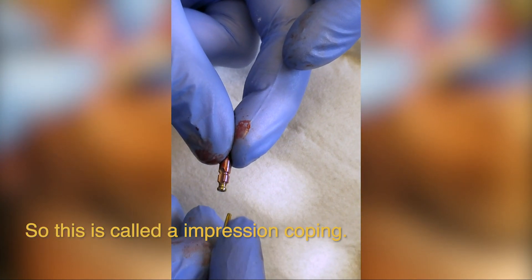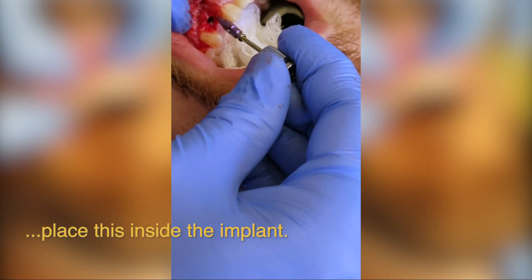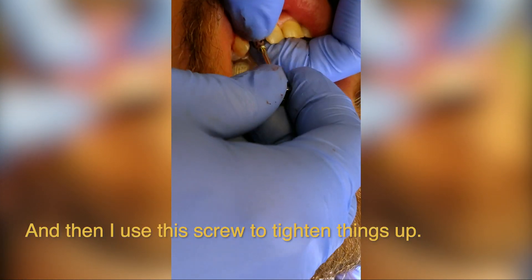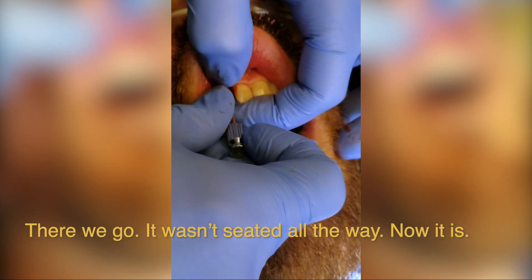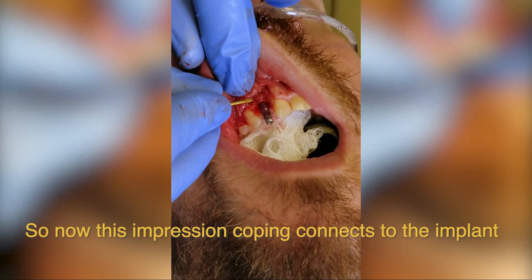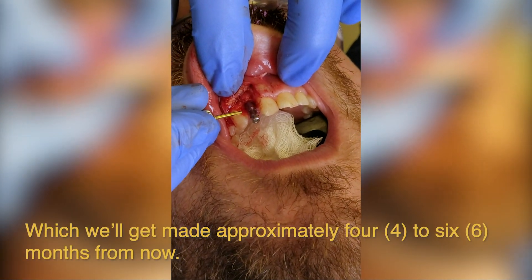This is called an impression coping, and this is the wrench — these go together, and this will fit inside the actual implant. I'm going to place this inside the implant and make sure it's seated down where I want it to be. Then I use this screw to tighten things up. It wasn't seated all the way — now it's seated. This impression coping connects to the implant and we'll be able to take a mold and then make a temporary tooth, which will get made approximately four to six months from now.